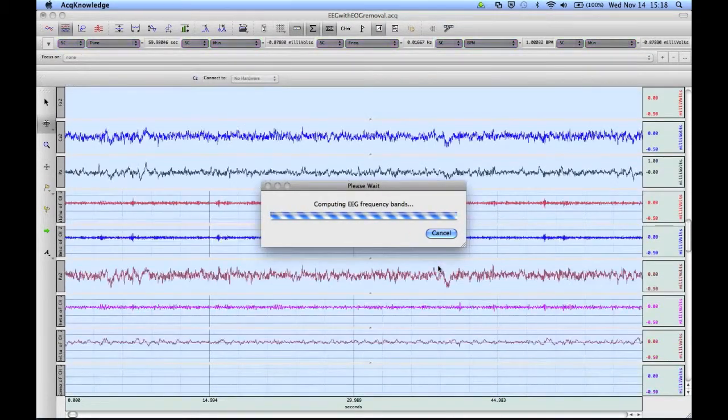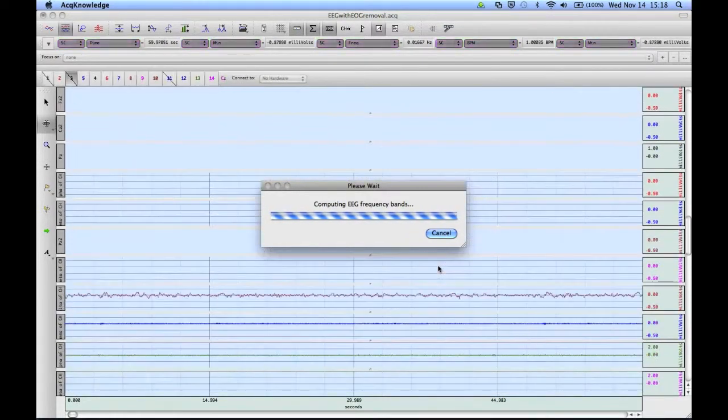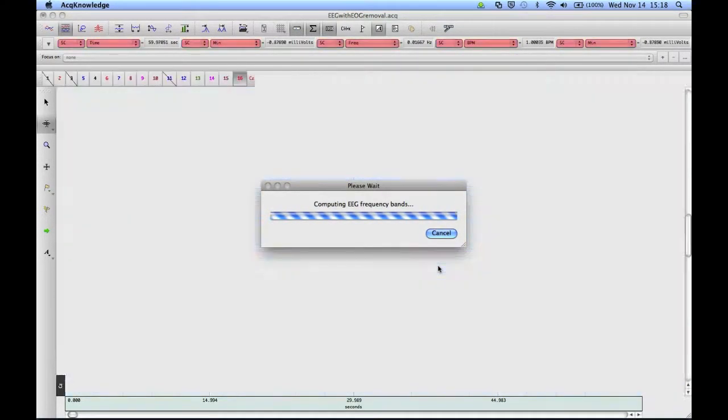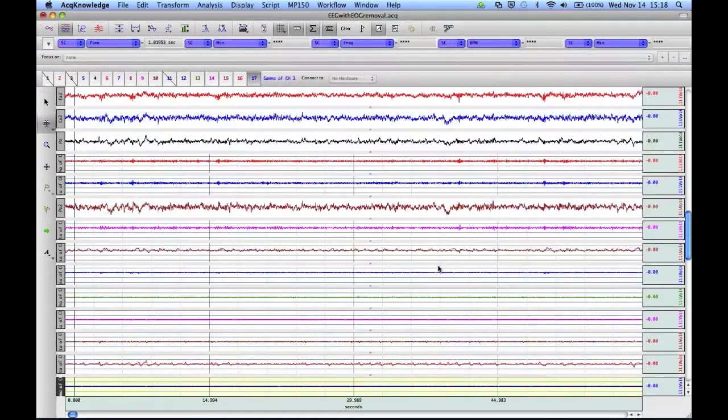This will pull out the Alpha, Beta, Delta, and Theta bands for each of the channels that we've selected.